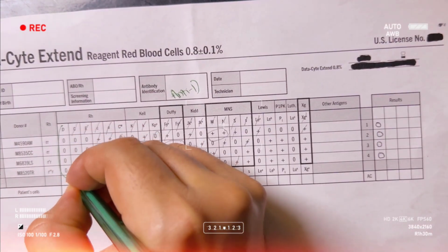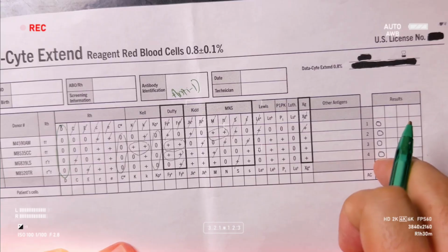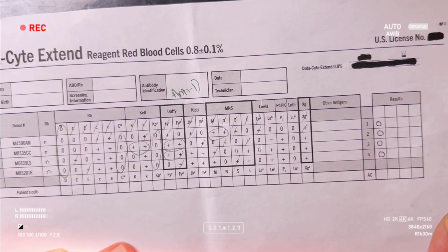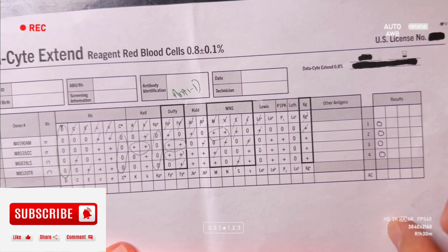You can see there is no reaction here. So this is the specific case of an Rh negative woman. She probably received a RhoGAM, that's why it's showing anti-D here. Anti-D due to RhoGAM. So this was all about antibody panel, antibody identification.